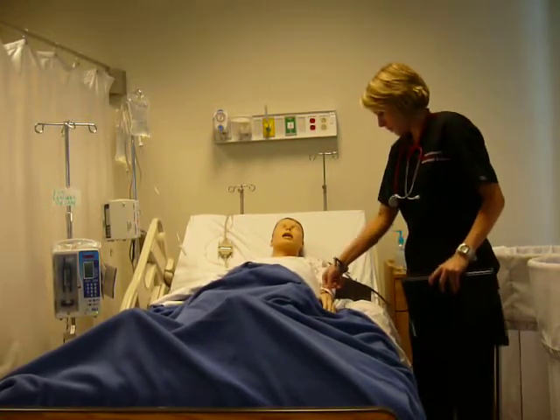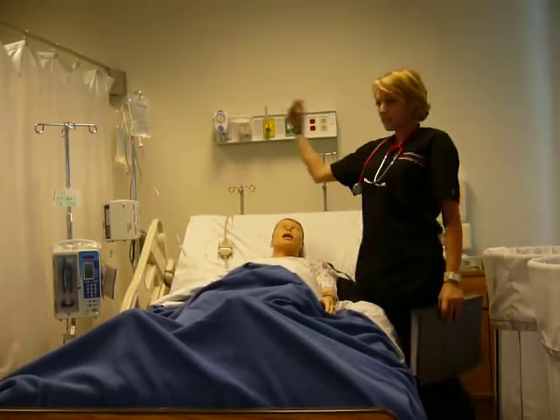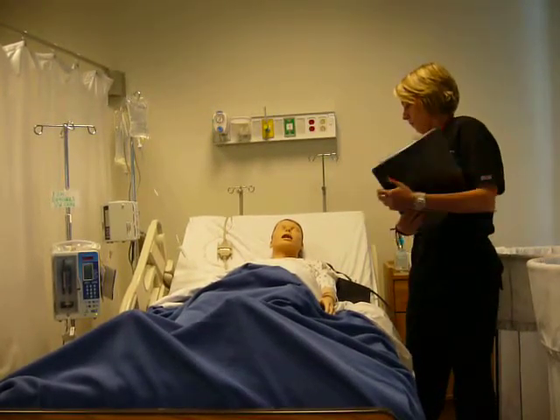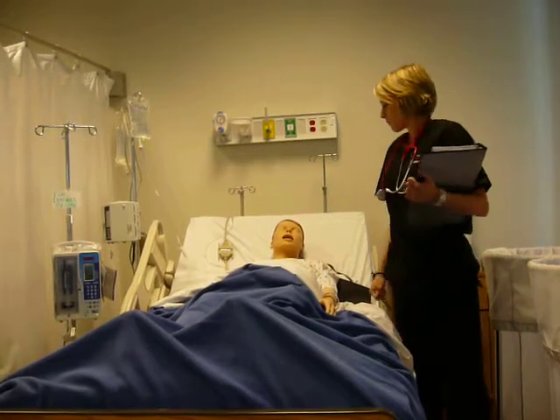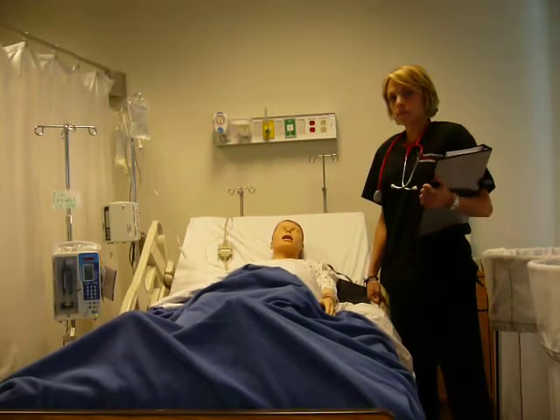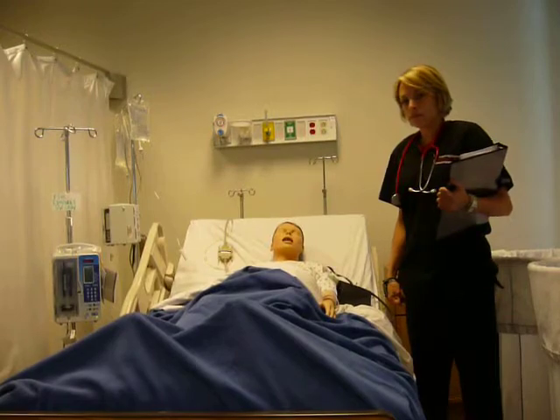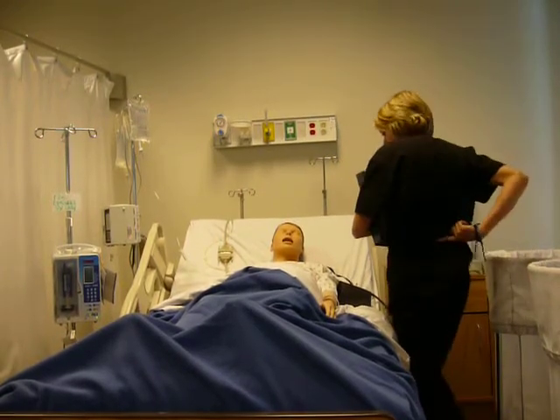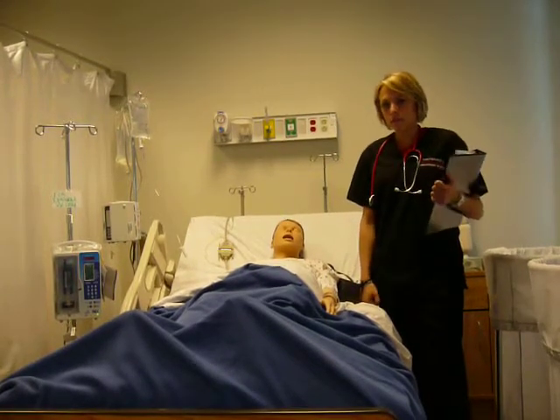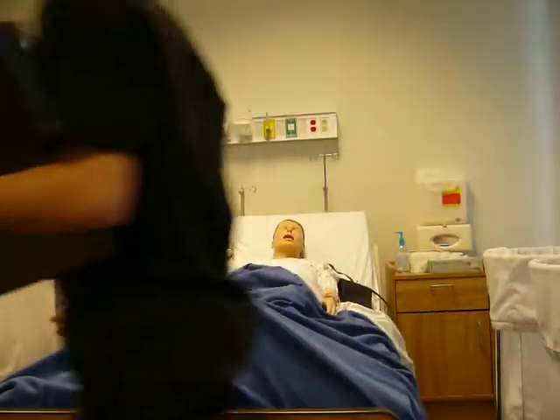Next, we're going to show the patient the device, which would be the epidural that is going to be put on them, as well as the infusion device. We're going to explain the function and the reason for the device. Obviously, for this patient, they're going to be having an epidural for the acute pain of pregnancy and labor. The epidural will be inserted at the L4 or L5 vertebra, or as the anesthesiologist prefers. So first we're going to provide privacy by shutting the door or pulling a curtain. Our curtain is pulled.